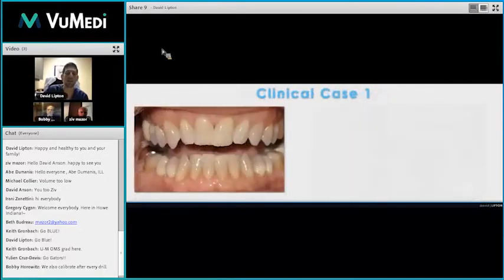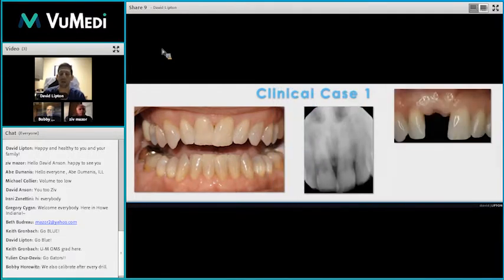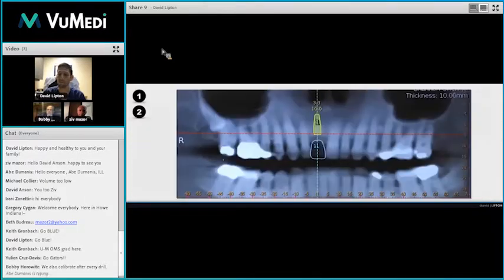So this is our first case, and this is Jen. Jen presented from the endodontist and her general dentist with a hopeless number 8 due to internal resorption. So this tooth was removed in an atraumatic manner. We performed site preservation with the materials that we use in our office, and after 3 months of healing, the patient obtained a CBCT. And with that data, we then started to plan our implant placement in site number 8.